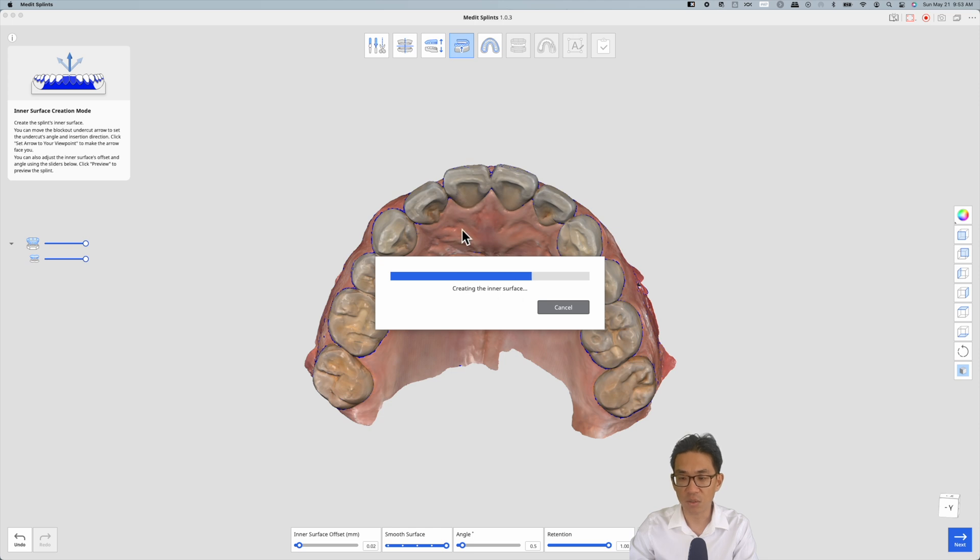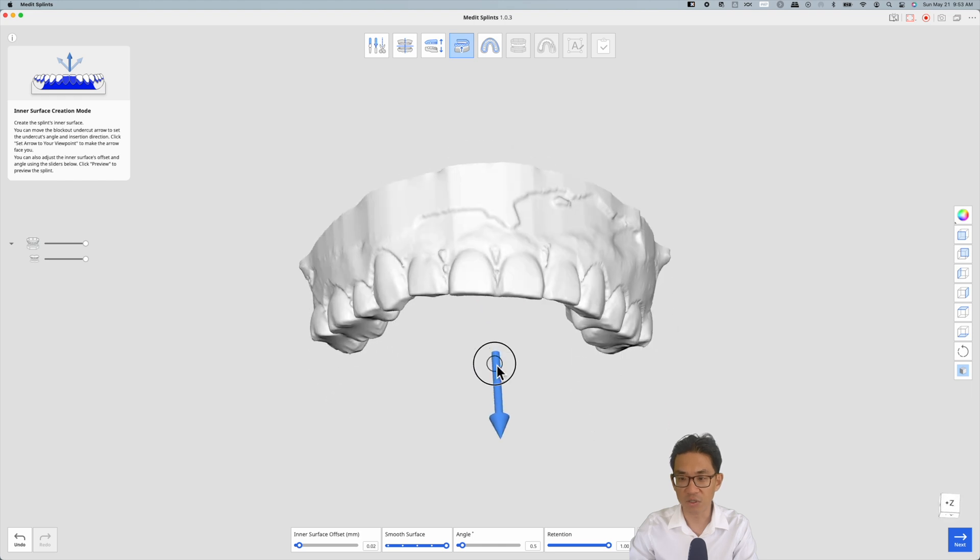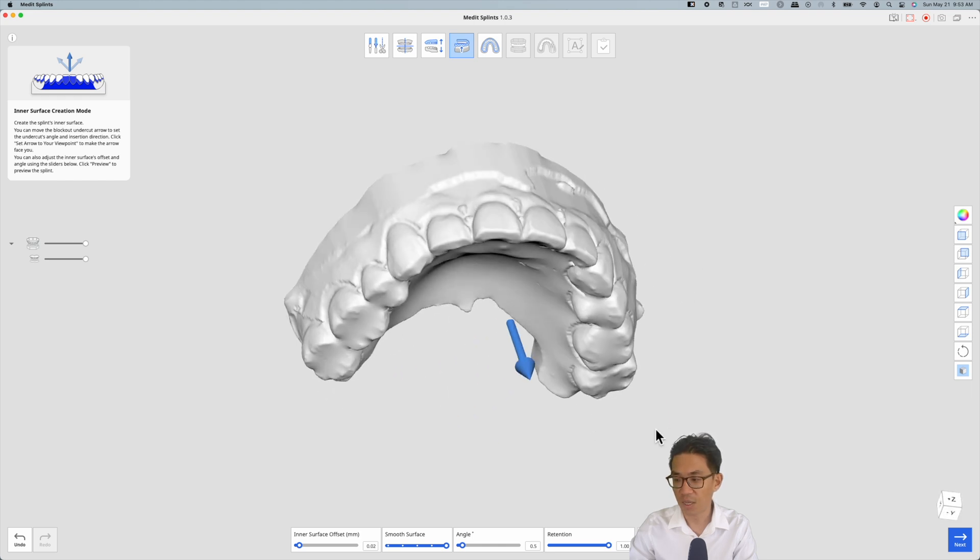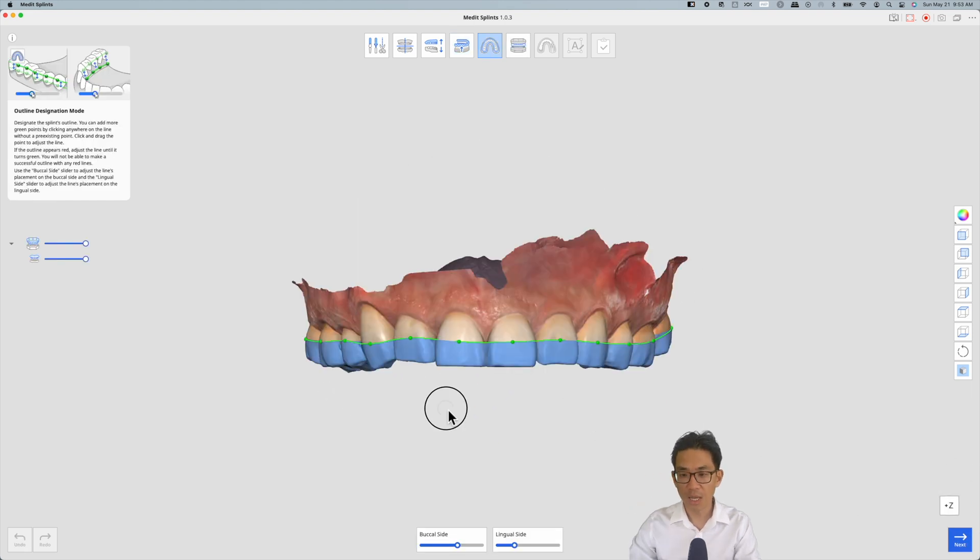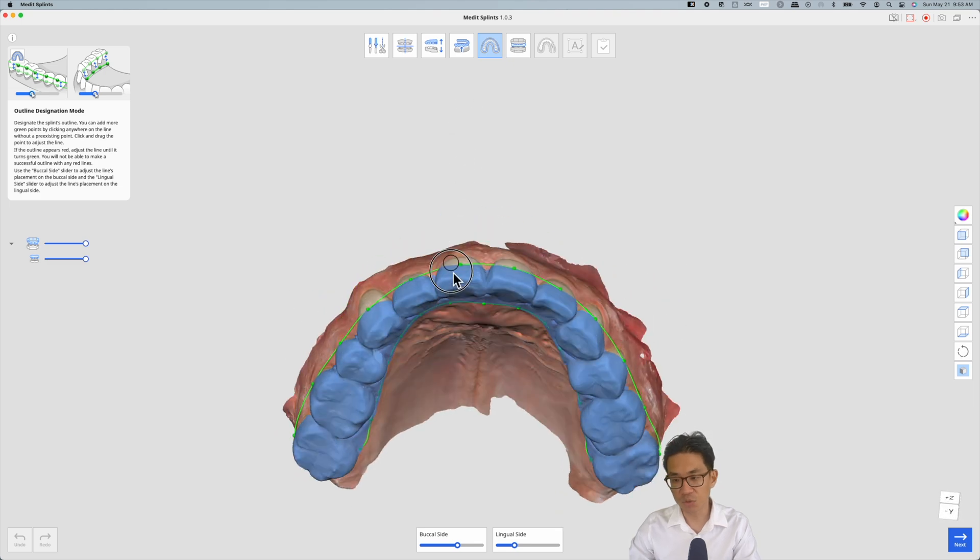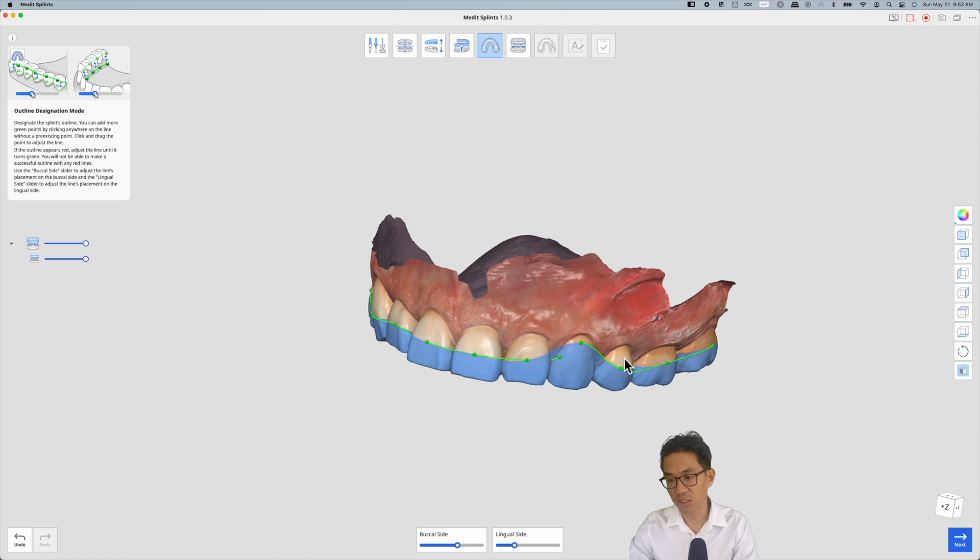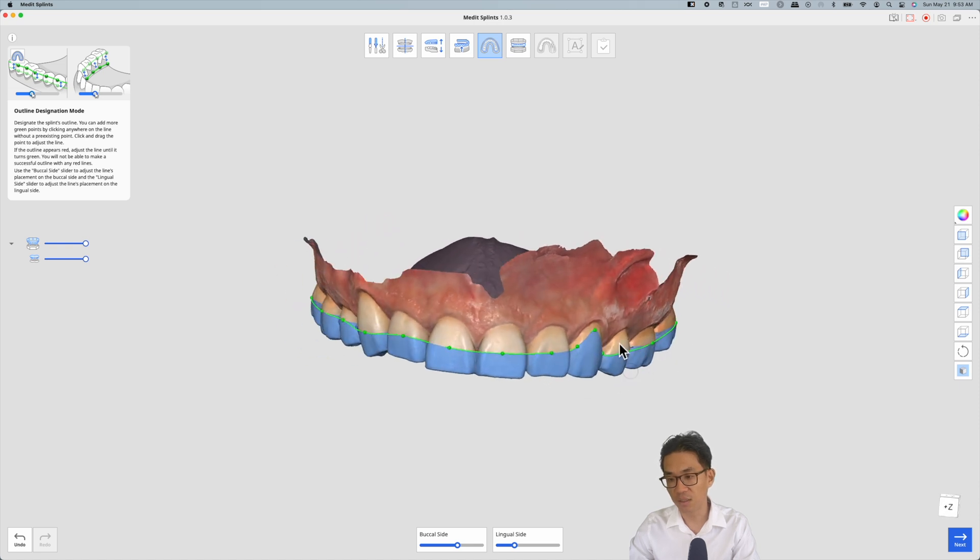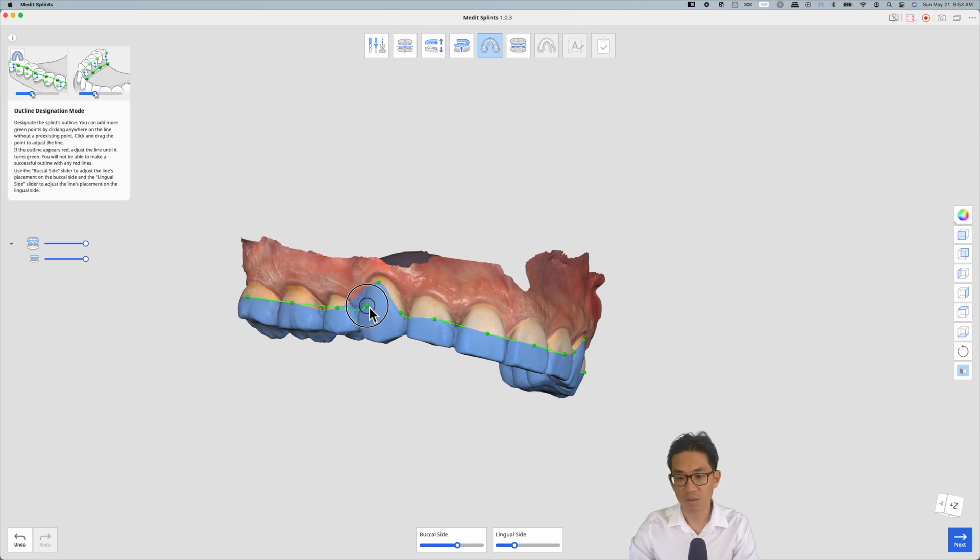It just creates the model with all the undercuts where the splint will be manufactured on. Hitting next, this allows you to adjust the outline of the splint. Let's say if I wanted to add some canine retention which some practitioners like to do, I'll add a couple bumps here.